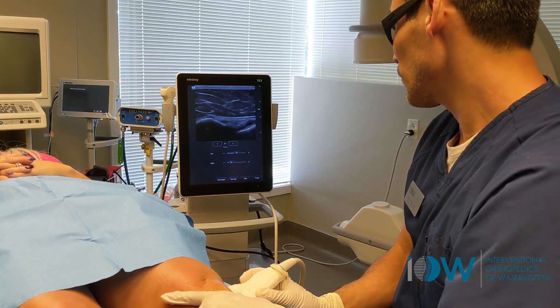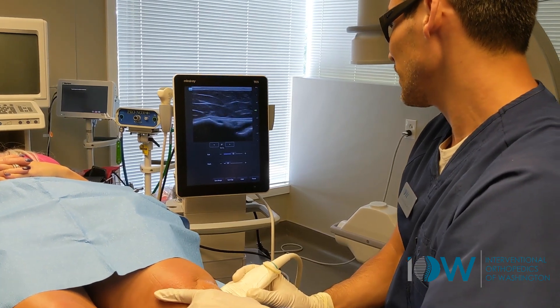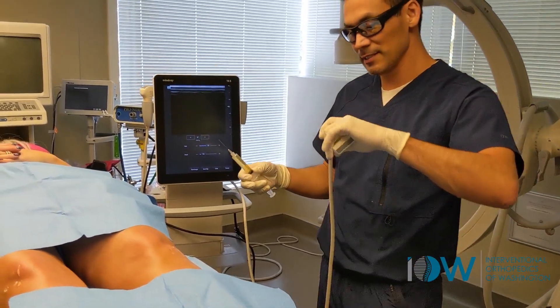We can see the joint space widening as I apply varus pressure on that LCL. There's that movement which likely contributed to stress of that medial meniscus.